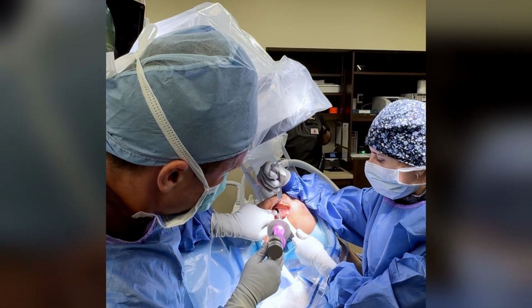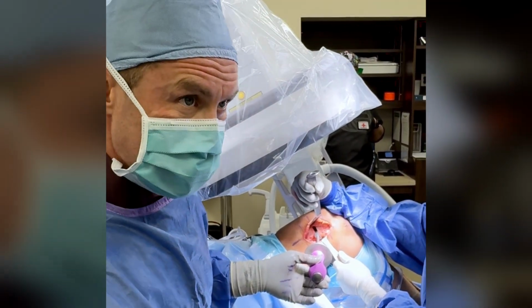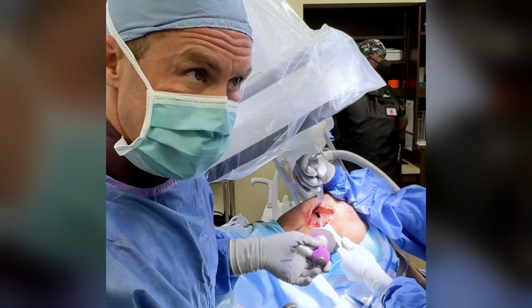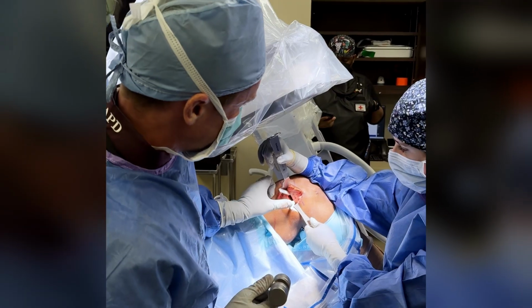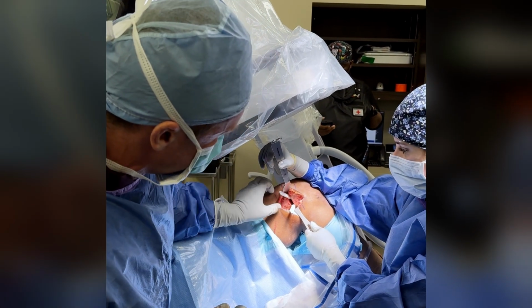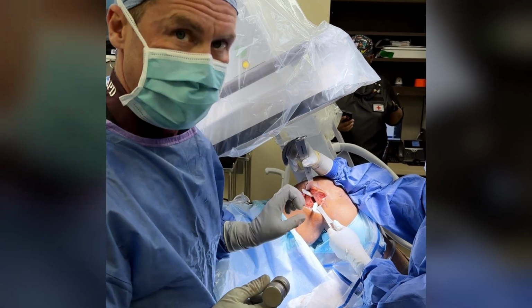There you can see the osteotomy opening up. So that's why it's called an opening wedge osteotomy. And then it opens up to correct the mechanical axis of the leg. We got our two lollipops, we call them, one anteriorly, one posteriorly here. There you can really see the osteotomy. And that holds it in position and allows us to drill for our plate.